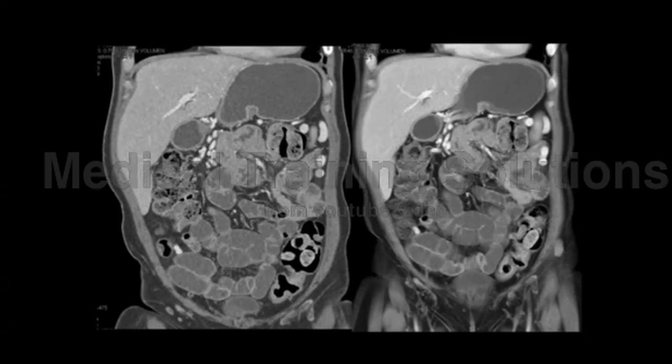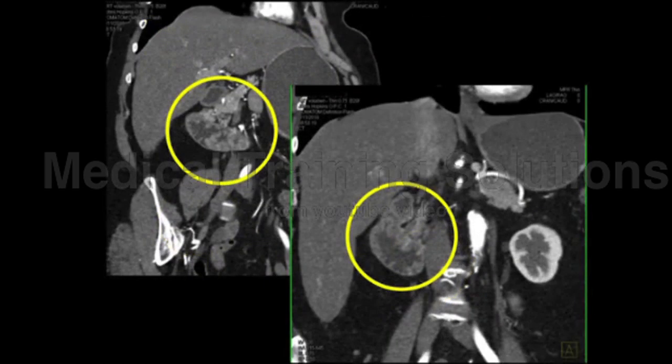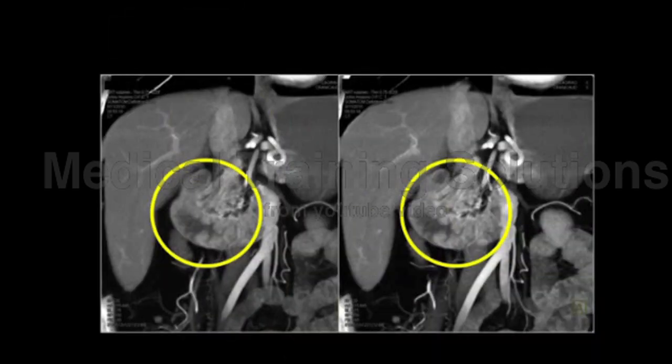Now, when you have pathology, look at this case of the duodenum. Look at the axial imaging. This patient has multiple enhancing polypoid lesions. Again, the axials do show it. You can see under the circle, but look how much better you see it in the coronal display. You see they're enhancing, not hypervascular, but there's enhancement. But more importantly, compare the normal mucosa of the duodenum with these lobular lesions. Very nicely shown again in this example.